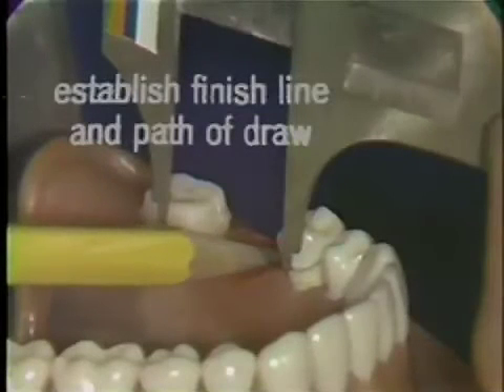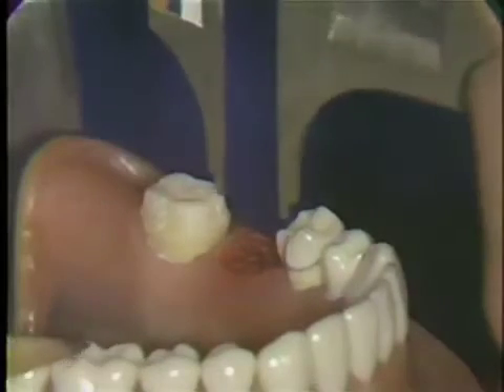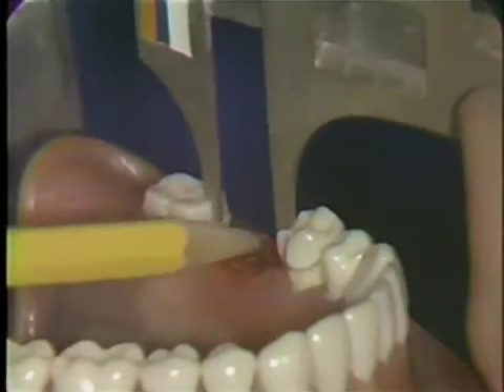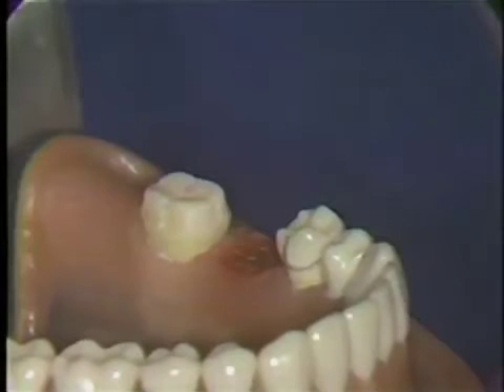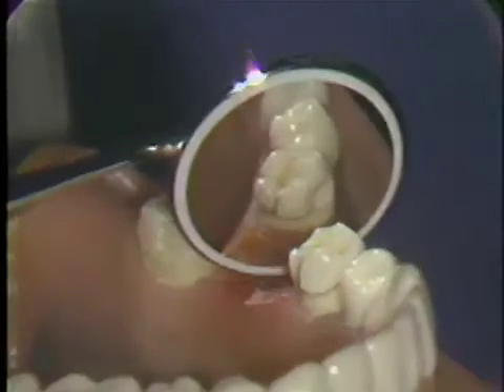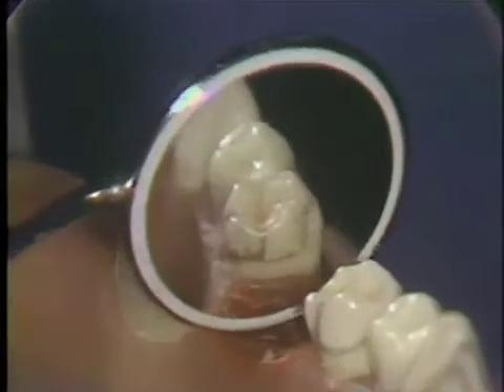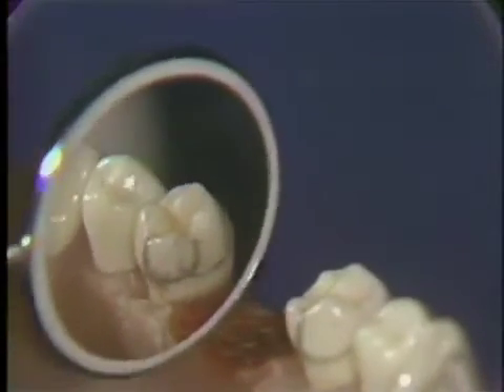The first step in the preparation of a three-quarter crown for the bicuspid is the establishment of the finishing line and path of draw. A Bowley gauge is used to place a distal pencil line parallel with the mesial groove on the molar. These pencil marks are the eventual position of the tracer cuts, and both lines should be parallel with the grooves on the molar preparation.